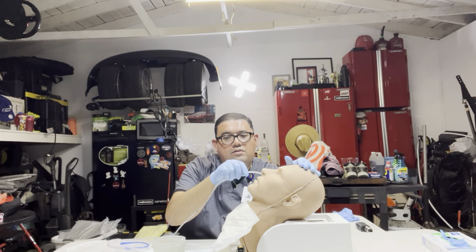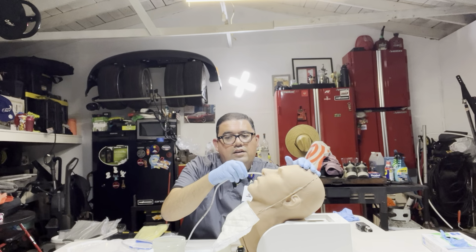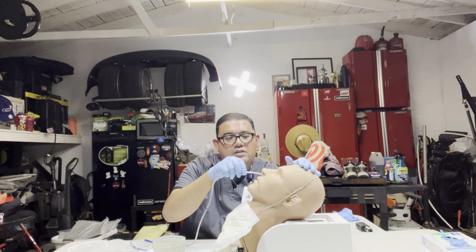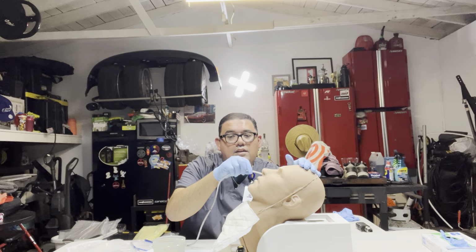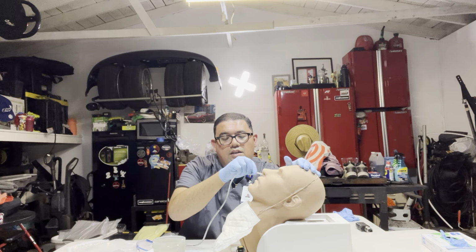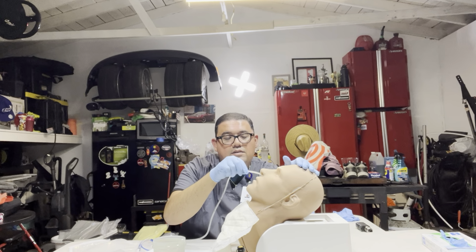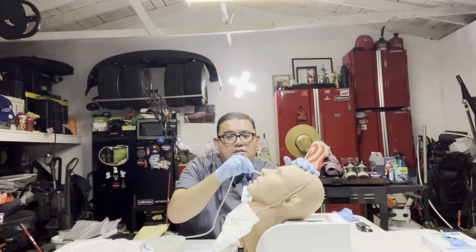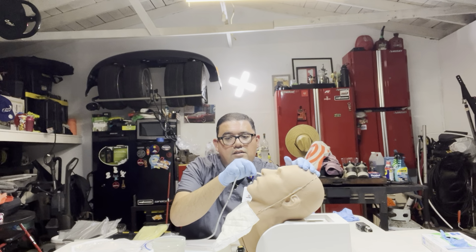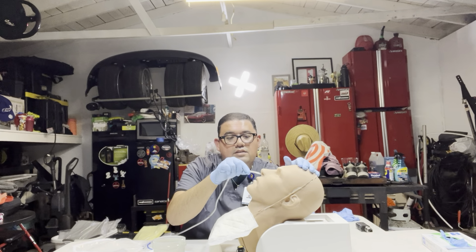Once the tube has reached the oropharynx, sometimes the patient would feel the tube in their throat and may gag or retch. If that happens, we can pause and then ask the patient to take some sips of water if needed. So we're going to keep on advancing the tube till we hit 60.